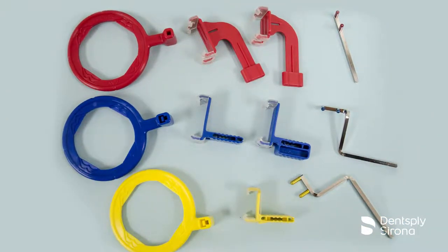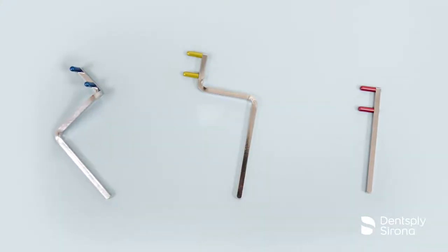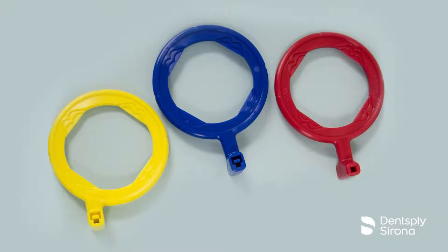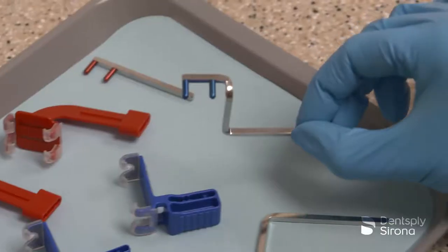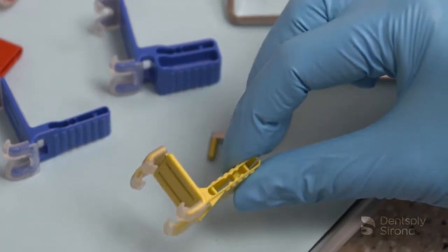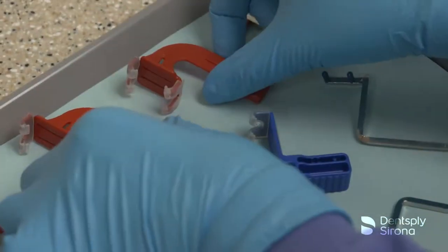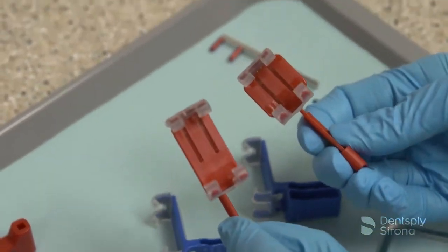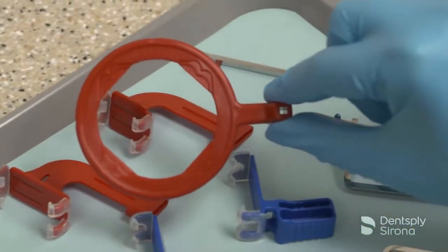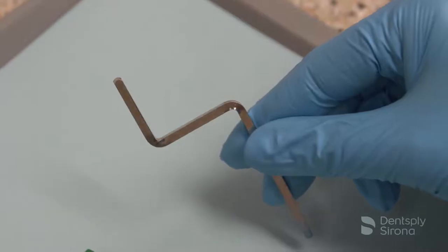The XCP short arm aiming device uses the XCP DS-FIT universal sensor holder and the traditional arm and ring sets, which consists of three metal arms and three color-coded rings corresponding to the area they will be used in the mouth. The blue bite blocks correspond with the metal arm with the blue pegs and the blue ring. The yellow bite block is for posterior periapical radiographs and corresponds with the metal arm with the yellow pegs and the yellow ring. The red bite block is used for bitewing radiographs and is available in a horizontal or vertical orientation and corresponds with the metal arm and the red pegs and the red ring. There is also a green bite block for use in endodontic radiographs and has a metal arm and a green ring.